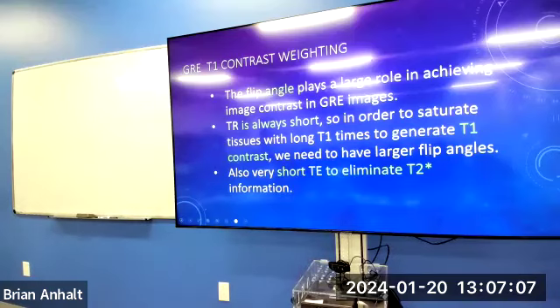So if I keep a high flip angle with a short TR, right? So high flip angle, 90 degrees, a little bit of recovery, we flip again, we have T1 contrast, right? If I want to get rid of T1 contrast, but keep the short TR, I just don't flip it as far. I lower my flip angle down to say 15 degrees, right?